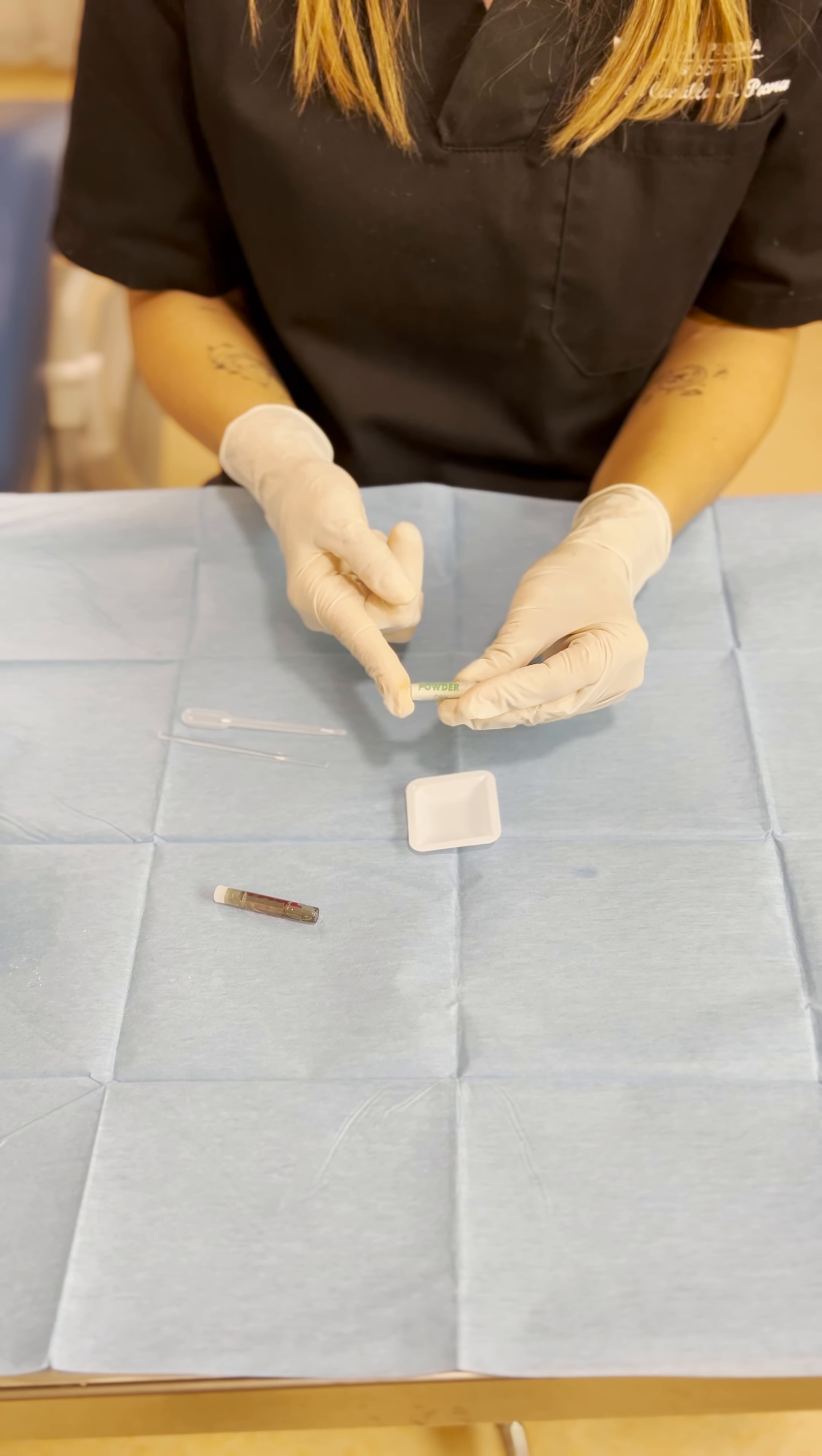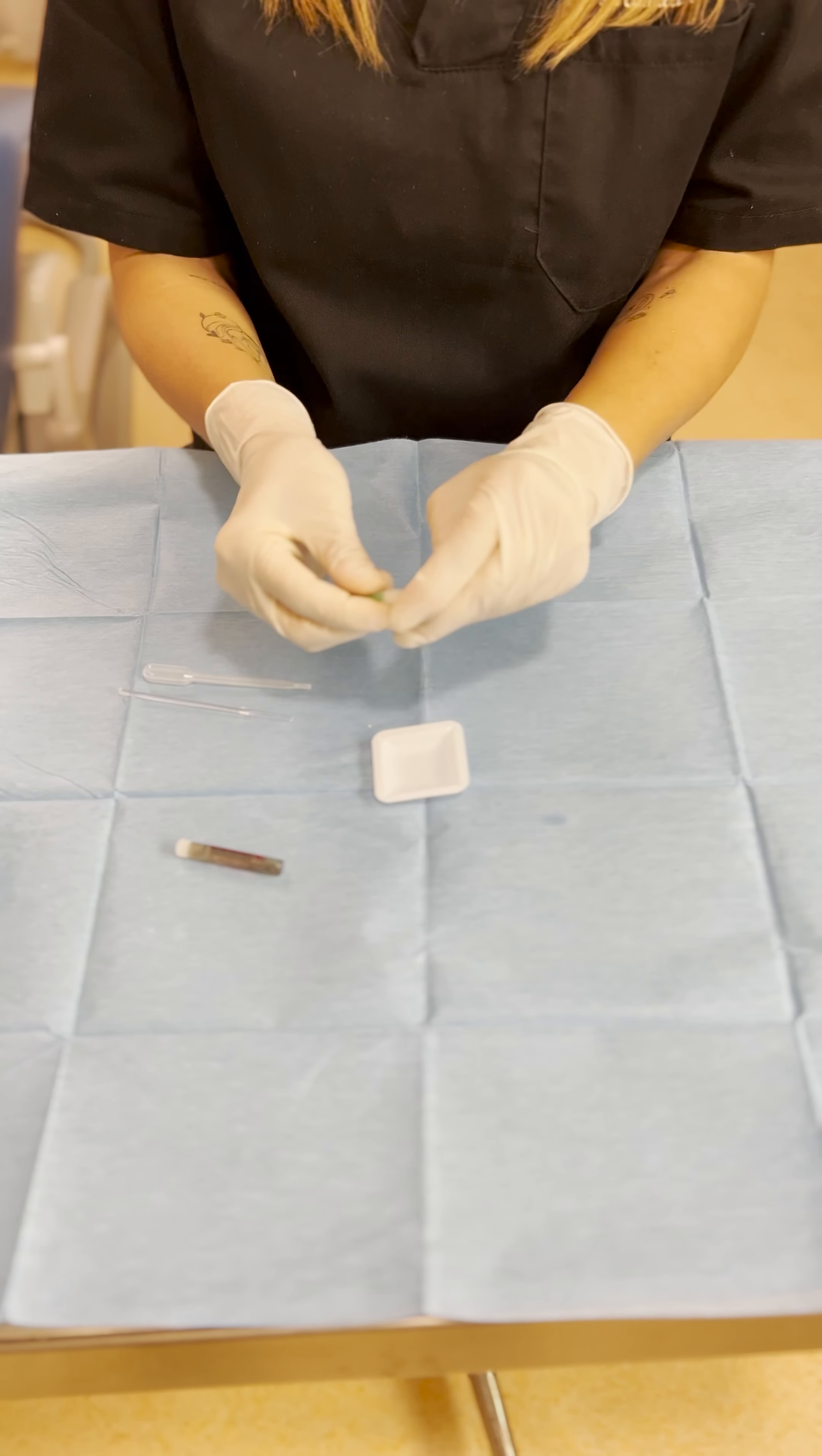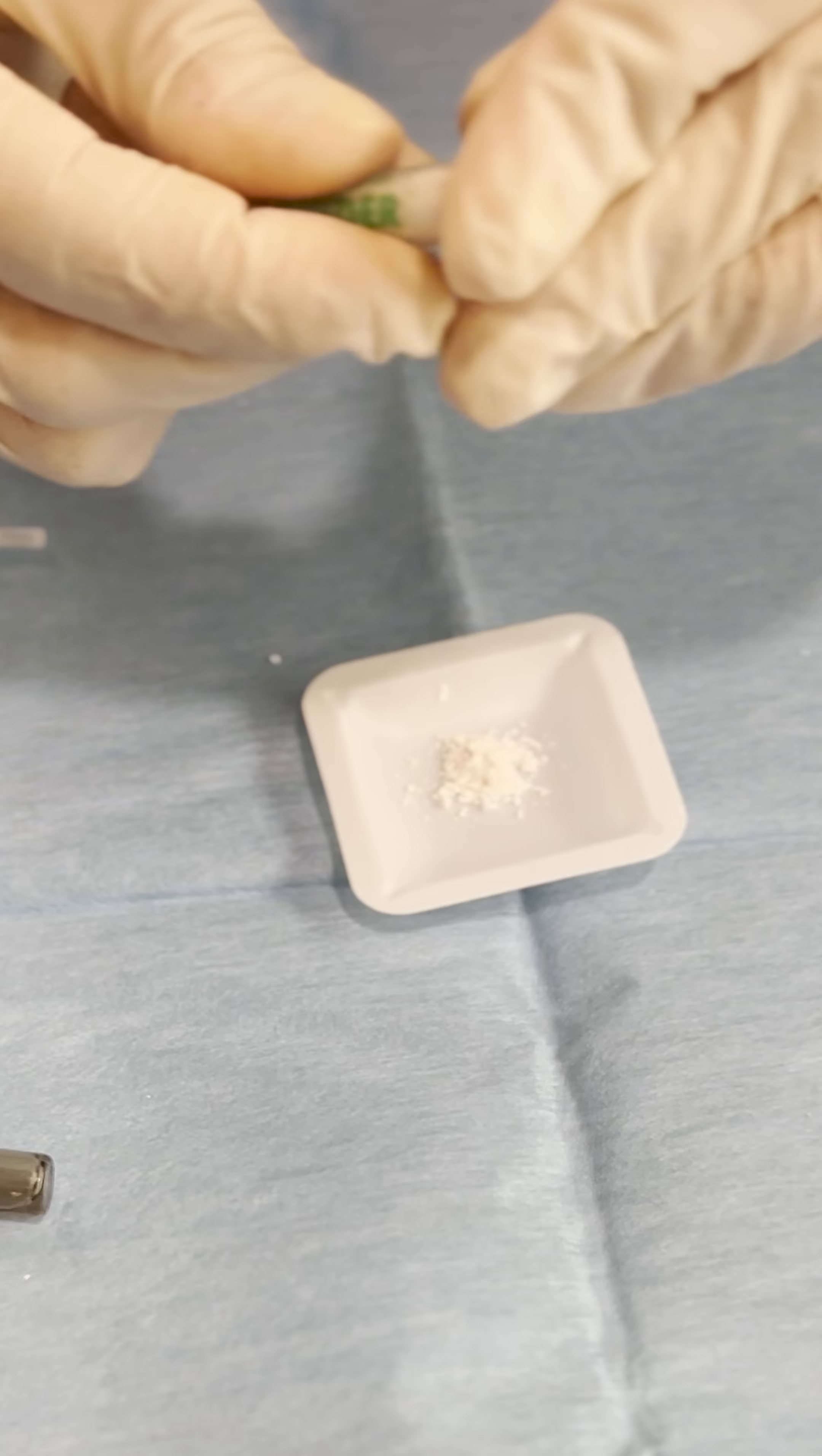Okay so this is the little vial with the powder and we can use it as a membrane on top of the defects to seal the granules inside especially if we don't want to use membranes or collagen on top of the defect.